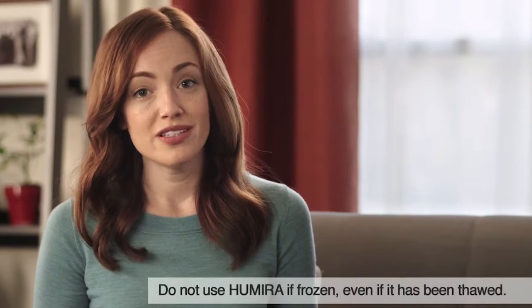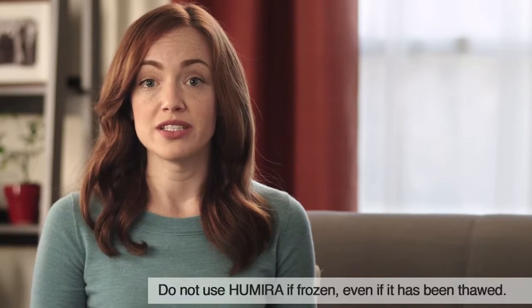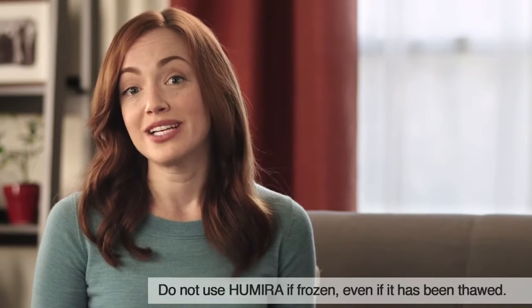I always check to make sure the medicine hasn't passed the expiration date. And also, make sure that it's not frozen, even if it's been thawed, and that it hasn't been exposed to direct sunlight. If it has, I won't use it. I'll use another pen in my fridge and call my pharmacy. Now, I'm going to inspect the pen.